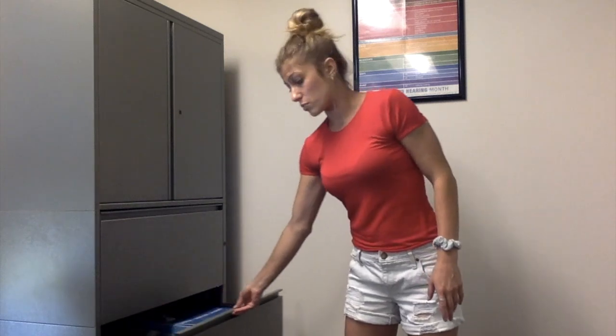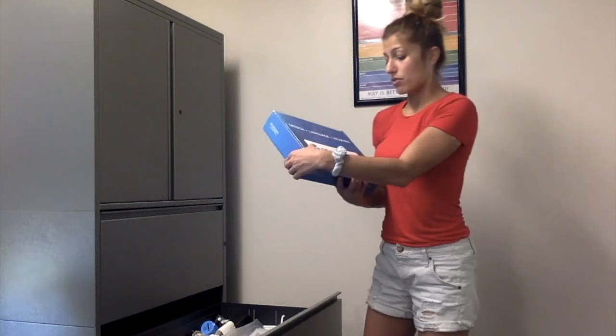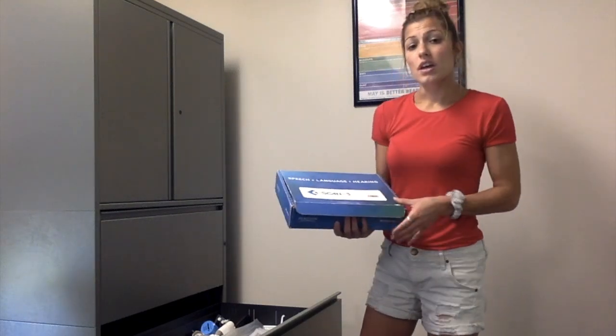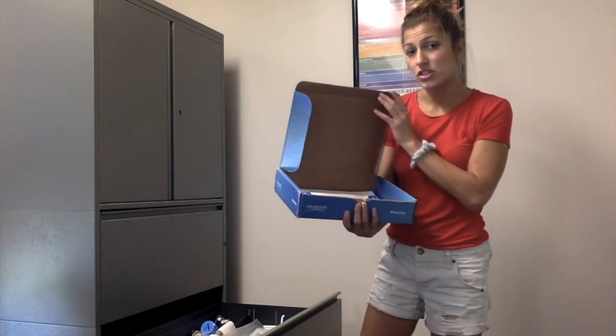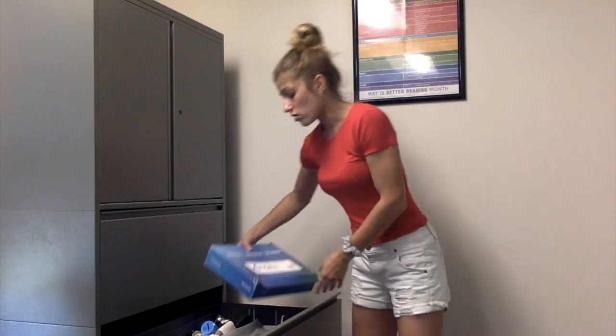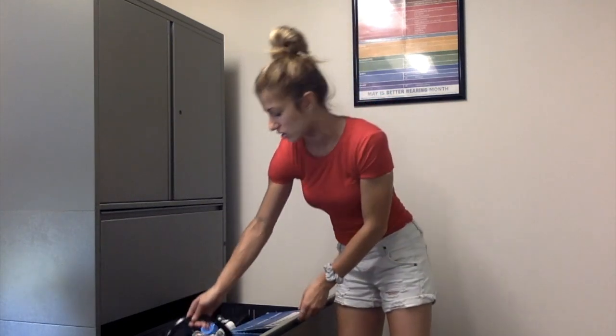In the second drawer is where you'll find your APD screeners. For example, the SCAN-3 for children is found in this drawer. If you open the box, you'll find the CD as well as the manual and screening sheets that you can use. Also in here is a portable CD player that can be used to perform the screening, if not in this room, in another clinician's room.